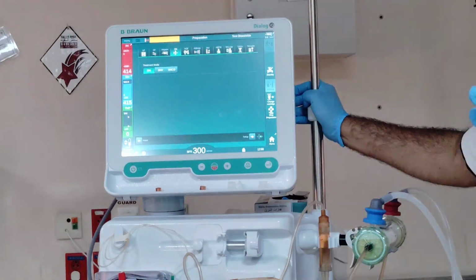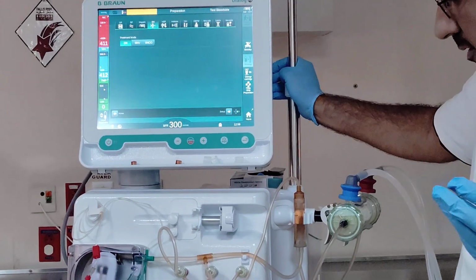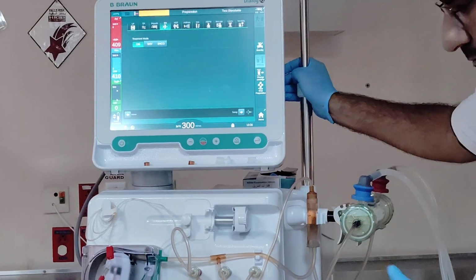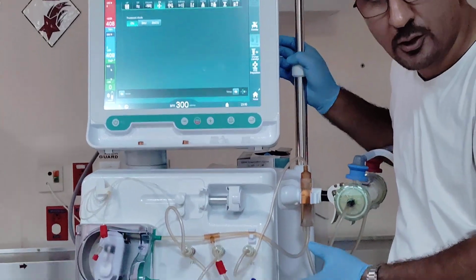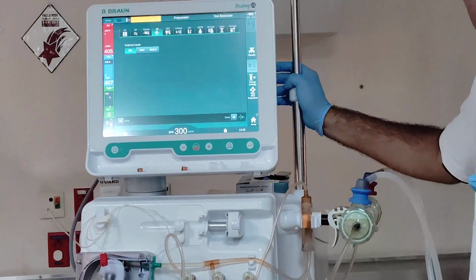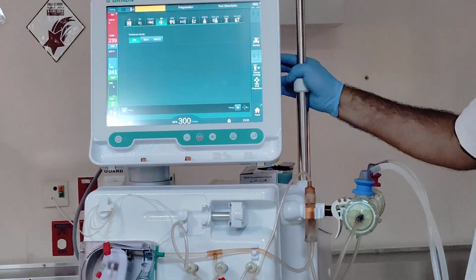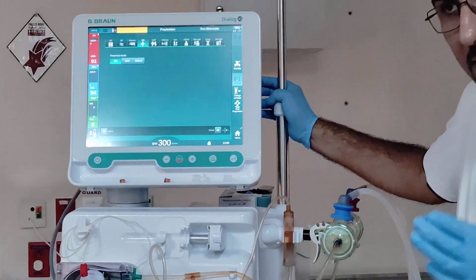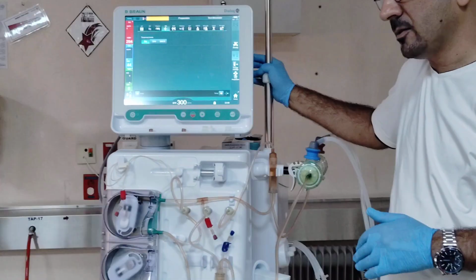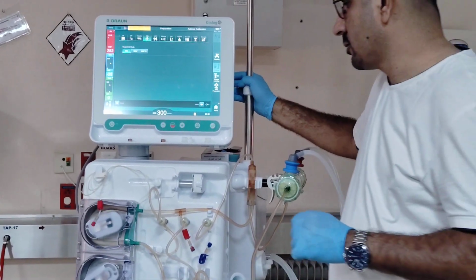The single needle valve, we can use this kind of therapy just in case we have an emergency, we can use the same kit of HD. But for the single needle crossover, we have a special kit with big chambers, and we can reach up to 90% of adequacy compared with the double needle therapy. Okay? This is for the single needle crossover.